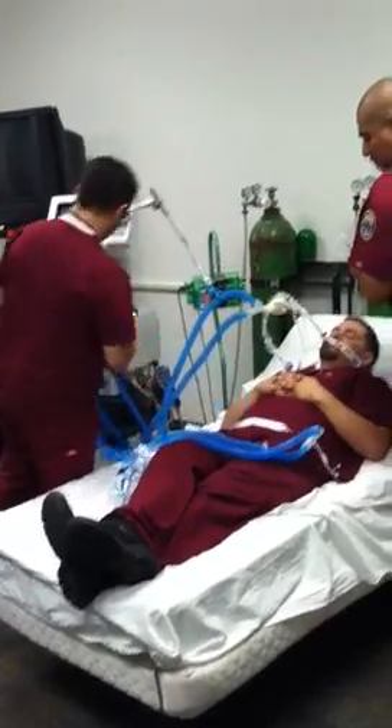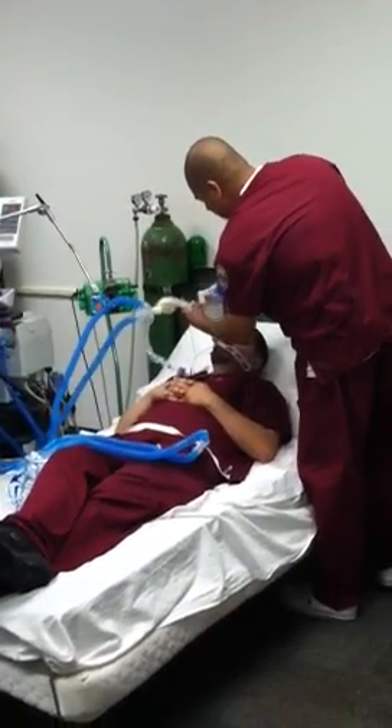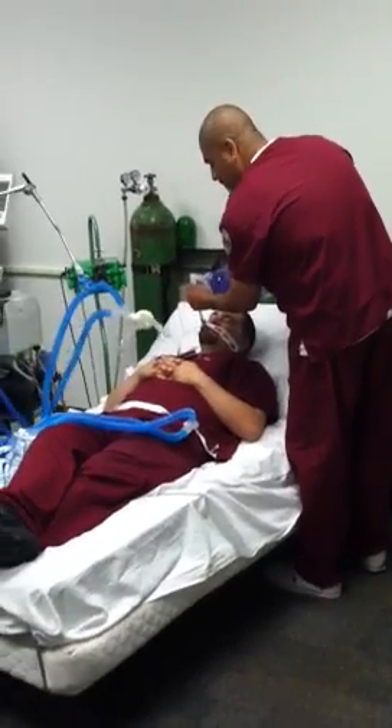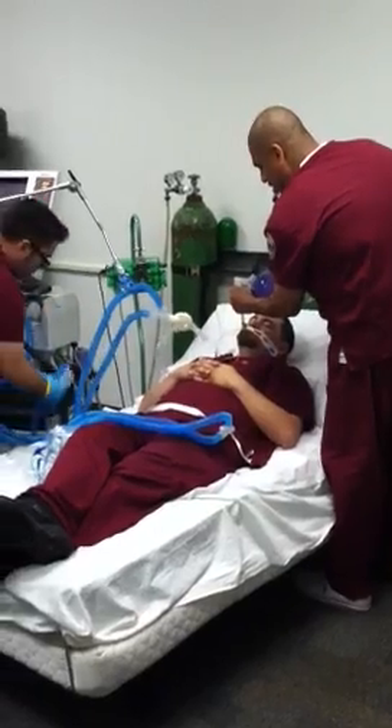As he changes, Orlando is going to manually ventilate the patient. If help is available — which they do have — he manually ventilates the patient during circuit disconnect. That way, the patient is properly ventilated when disconnected from the vent.